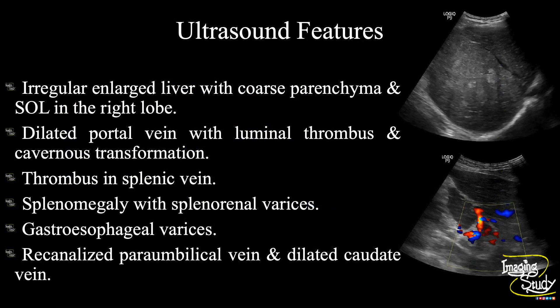In summary, the liver is enlarged in size, irregular in shape, with coarse parenchyma and multiple heterogeneous space-occupying lesions within the right hepatic lobe. The main portal vein is dilated with luminal thrombi and cavernous transformation. Thrombi were also seen within the distal splenic vein. The spleen is enlarged with tortuous splenorenal varices, and tortuous vessels around the gastroesophageal junction indicate gastroesophageal varices. We also identified a recanalized para-umbilical vein and dilated caudate vein. Final impression: hepatocellular carcinoma with hepatic metastasis on the background of chronic liver disease with portal venous thrombosis, cavernous transformation, and development of portosystemic collaterals.